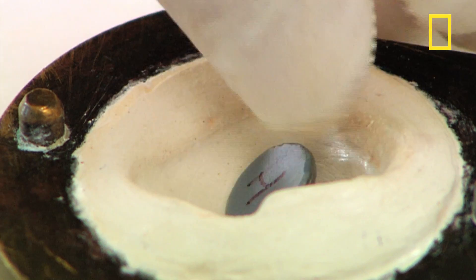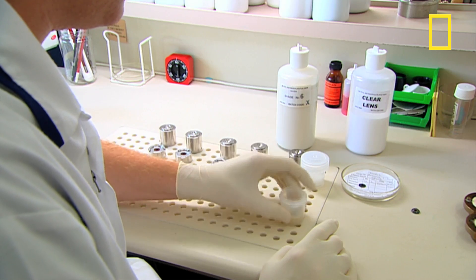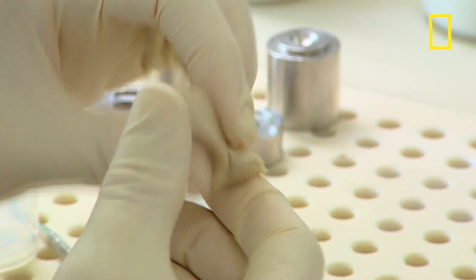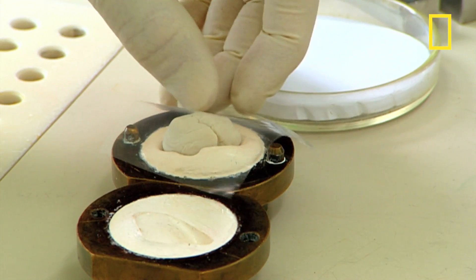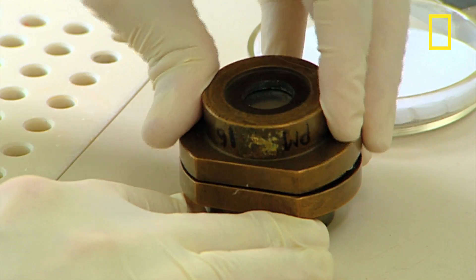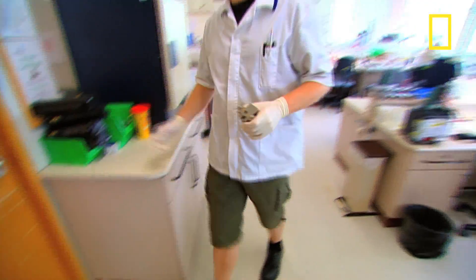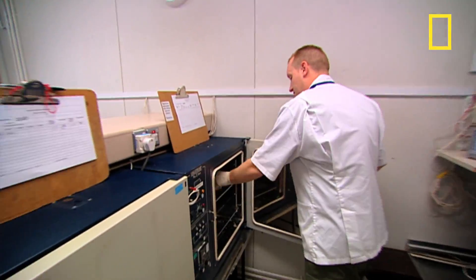The iris is placed upside down in a mold and the white of the eye is made. It's made out of poly-methyl-methacrylate, a medical grade acrylic plastic similar to the material that's used to make false teeth. Once prepared it's squashed down into the cast of the top of the iris and the whole mold goes into an oven for two and a half hours.